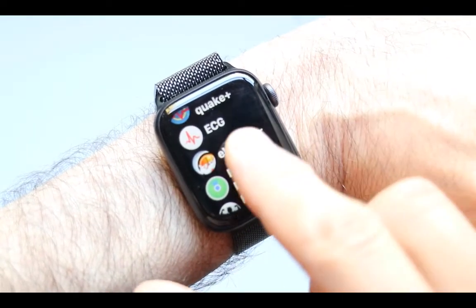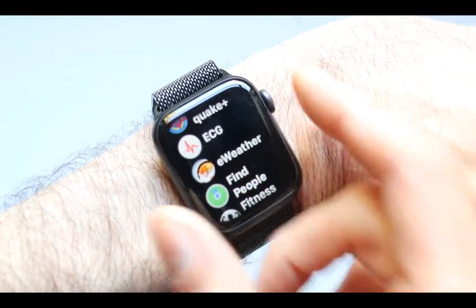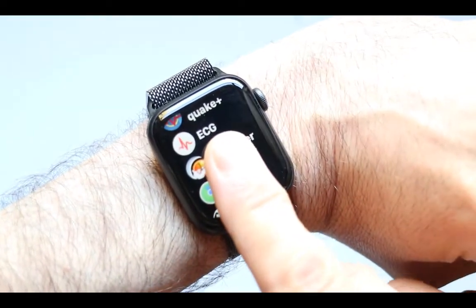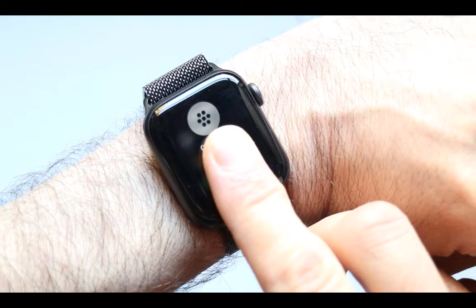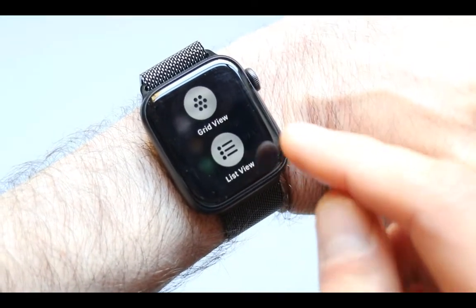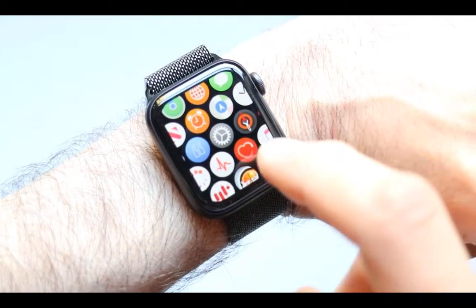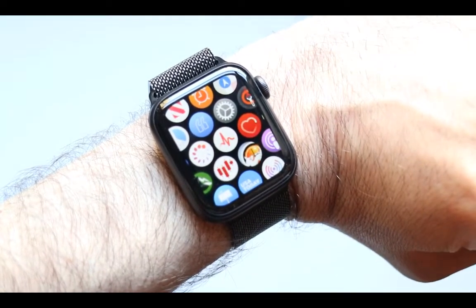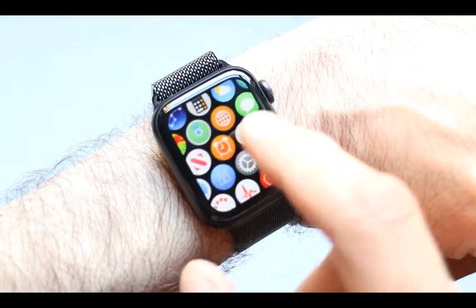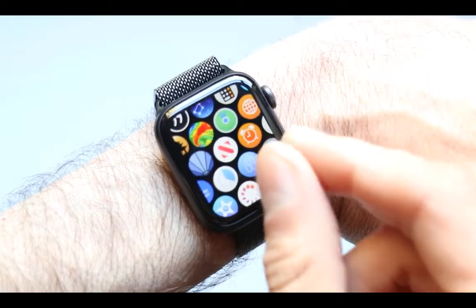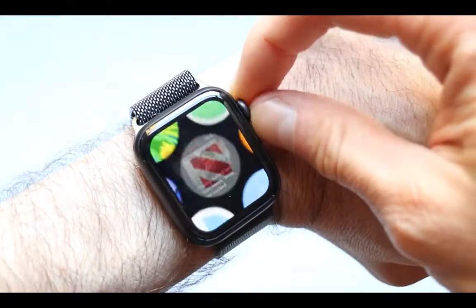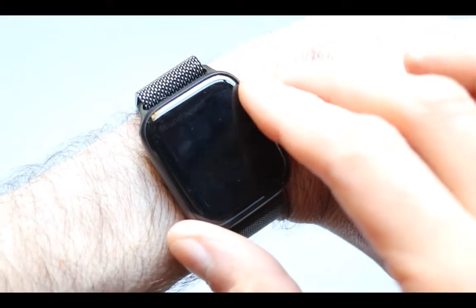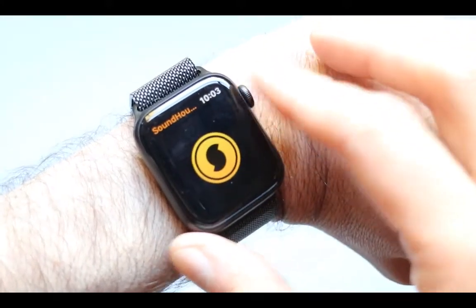There is another way for you to find this if you don't like scrolling through the list view. What you have to do is just click on it, press and hold like this, and you're going to go into grid view. From there, press on the app that looks like the EKG icon. This is a little bit complicated because, as you can see, there are all those apps and you have to try to find the correct one.